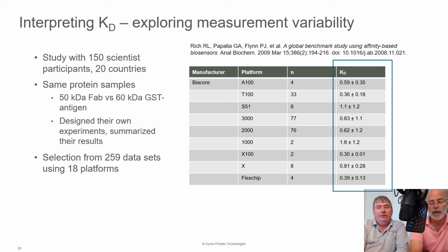I think again to point out maybe the obvious, but since it's a relative measure, if you're screening a series of compounds and you care about the differences between them, as long as they're screened on the same day under the same conditions, you should get pretty good rank order affinity measurements using the Gyrolab system.